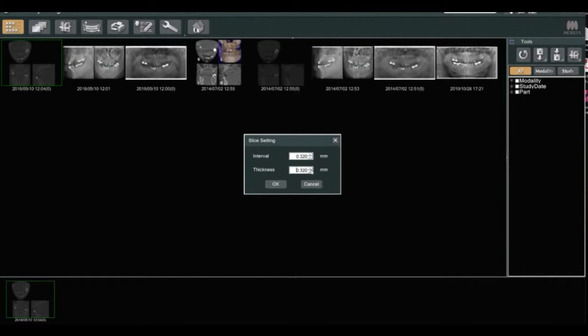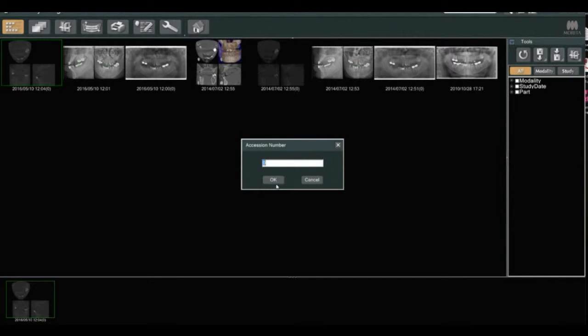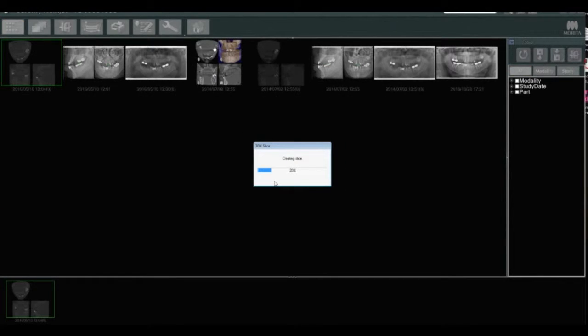Then you pick the thickness that you want, which is .3 or .4 is what you want. Click OK and now it's exporting to your folder.